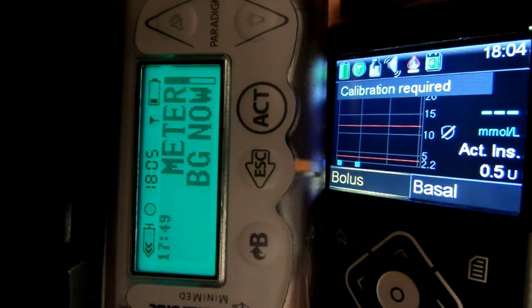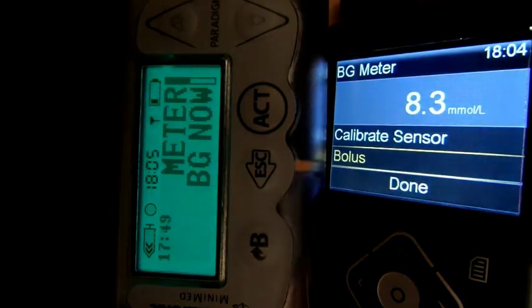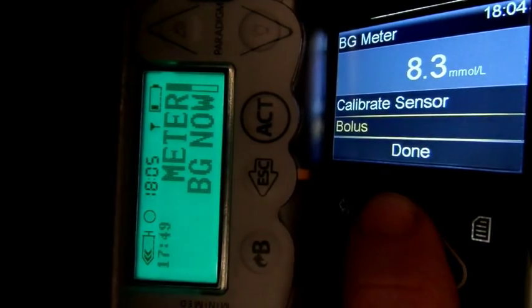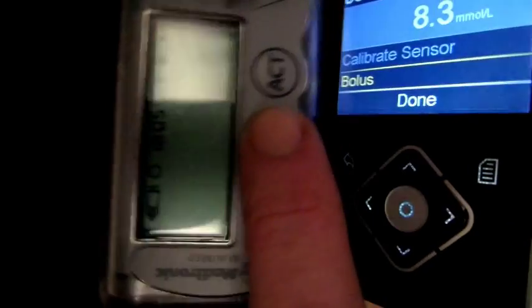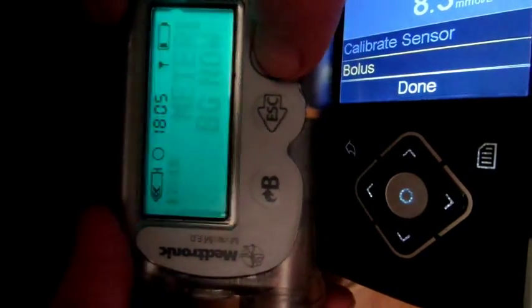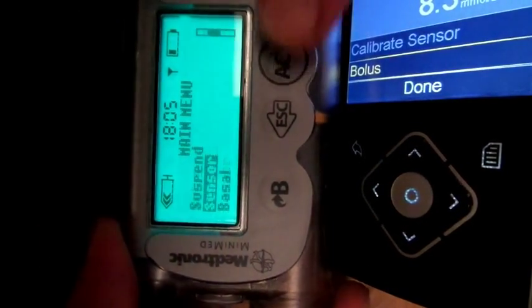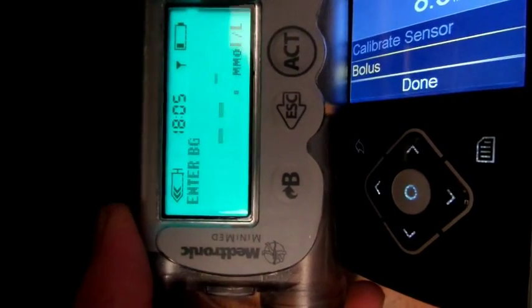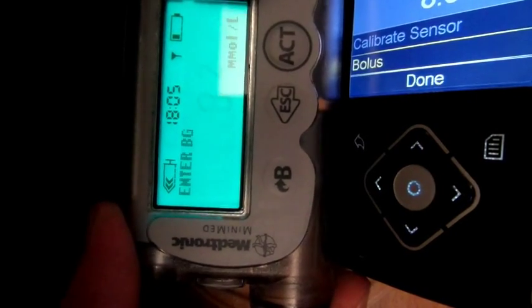Calibration required. You can see 'meter BG now' on the Veo and the calibration required there. Just done my BG — it's 8.3. That's been sent through. So let's go up and calibrate the sensor. So that's calibrated. Perfect. And then I shall start the Veo off on the same one, so they're both starting on the same footing so we can see how they both go on the tracking. Sensor calibrate 8.3. Up and running.